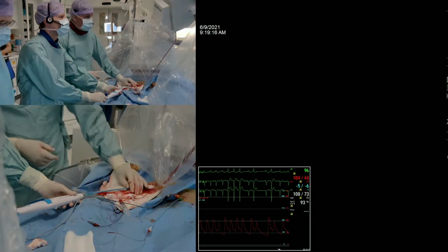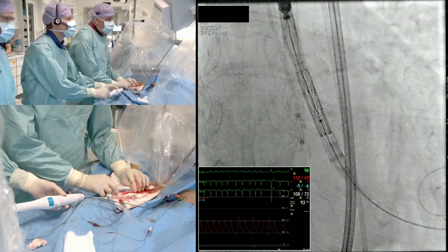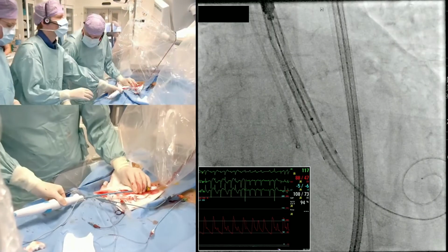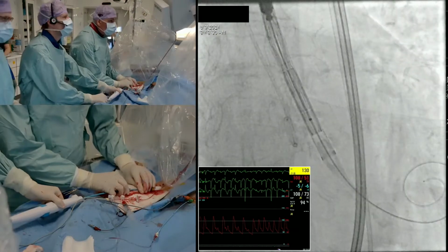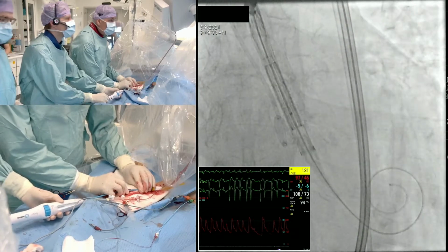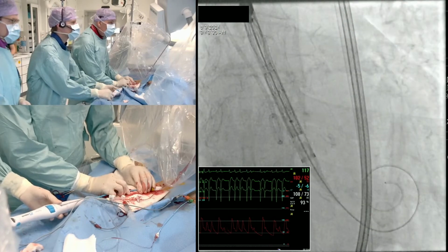What we could try, Ole, is to make a commissural alignment here. So we can try to rotate, and looking at the posts at the top here, in the middle of the frame, we want to see if we can isolate one. Just give me 1 second here. So let's try to rotate a little bit here on the delivery system and see if you can have one of the posts on the far right hand side of the screen.